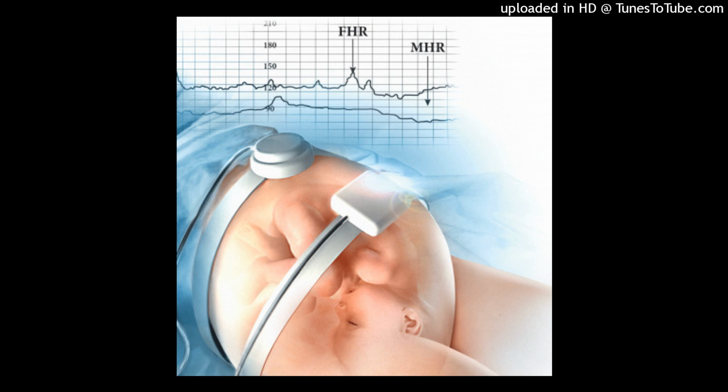Electrodes should not be placed if there is an unidentifiable presenting part, placenta previa, hemophilia, maternal human immunodeficiency virus infection, visible genital herpes lesions, or patient report of prodromal lesions symptoms. In cases of extreme prematurity or in the presence of a maternal infection such as hepatitis, group B hemolytic streptococcus infection, syphilis, or gonorrhea, electrode placement may be acceptable if fetal benefit outweighs risk.